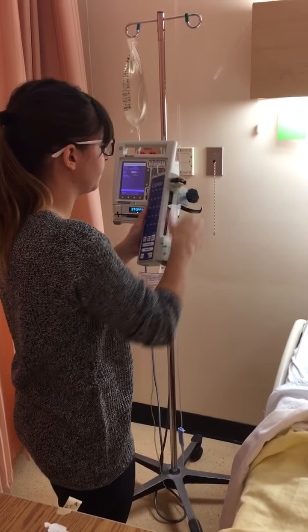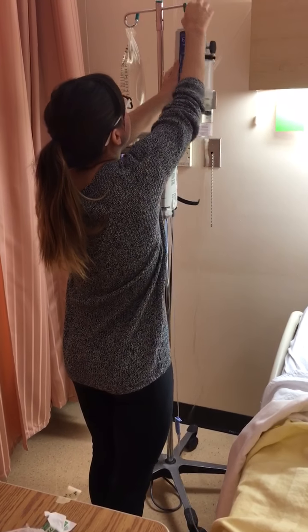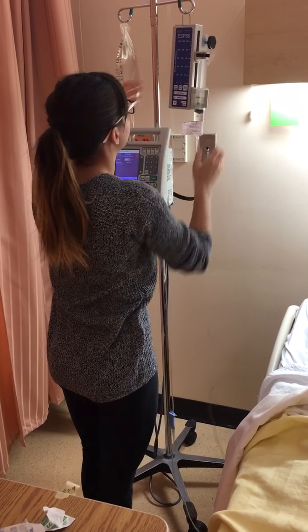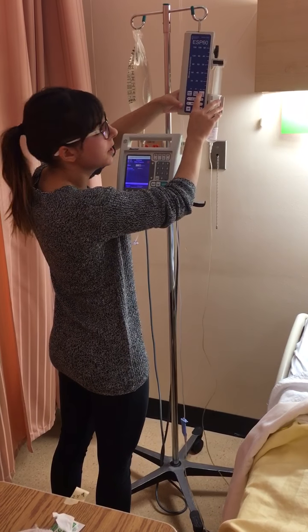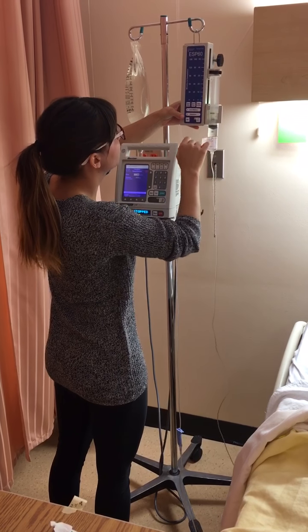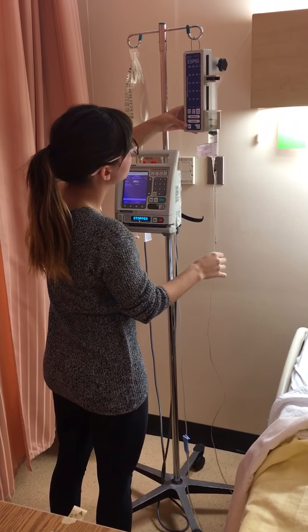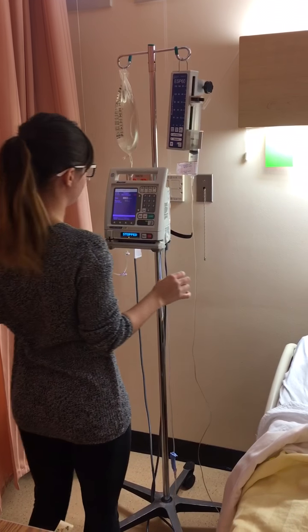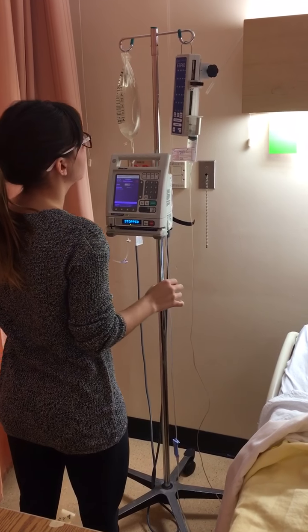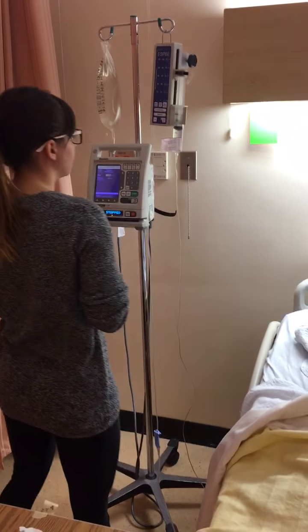Okay, so we're going to put it on normal because that's what it said there. So normal. Okay, the primary infusion is compatible.